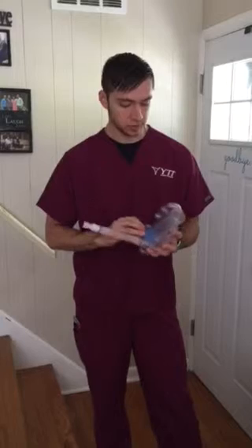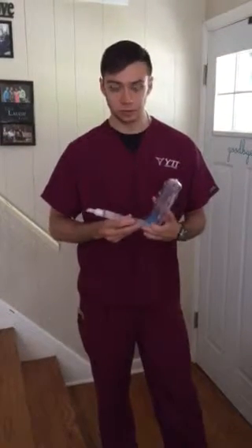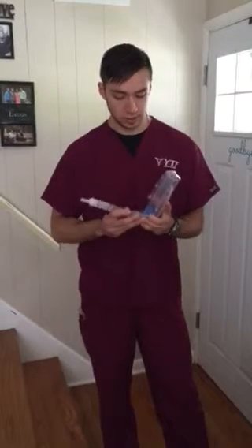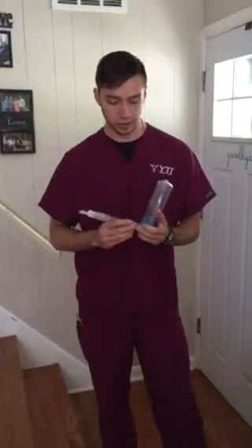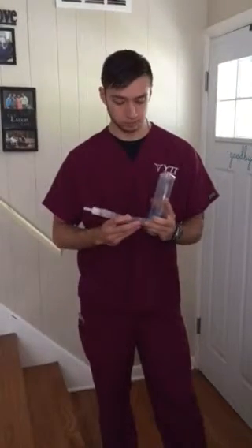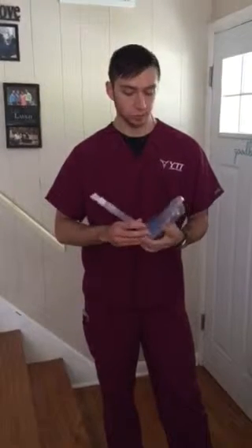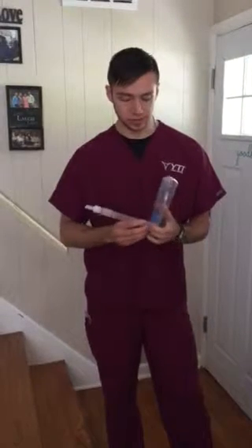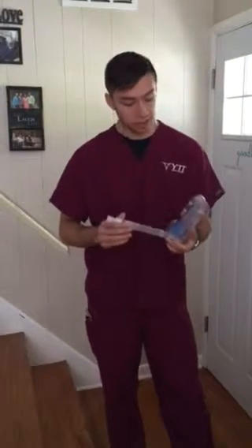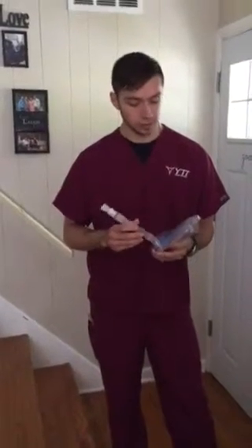But a lot of these patients are in a lot of pain and will not be able to do what they're supposed to do, so just coaching them to do the bare minimum, just at least give a good try and a good effort will be good enough. By the end of their stay, they should be able to go more than half. And if the patient is still in a lot of pain whenever they leave, they can take this home with them. They can do it at home if they're not being very active.